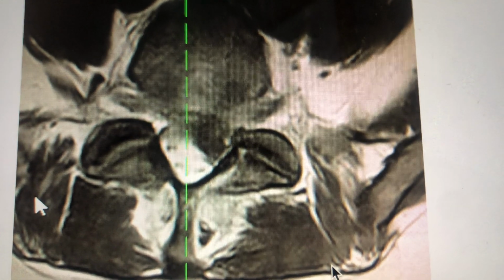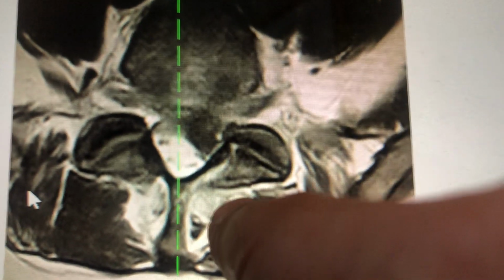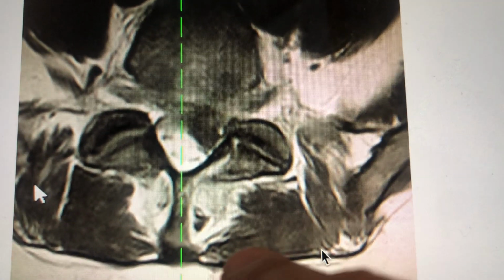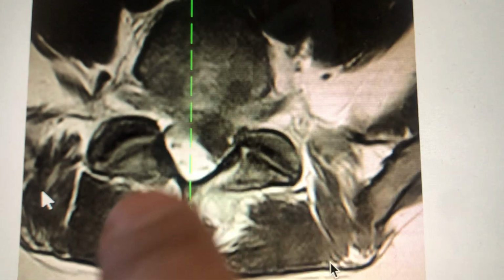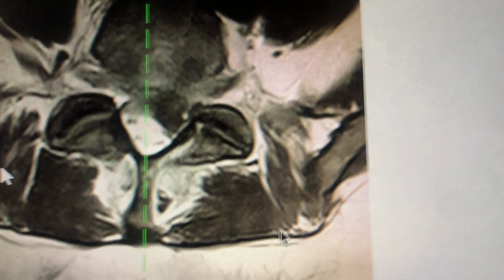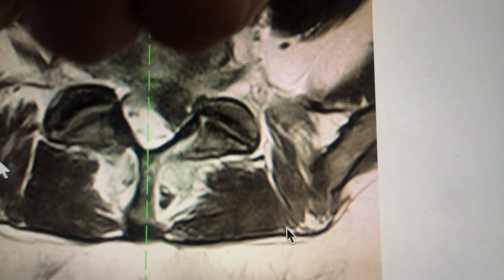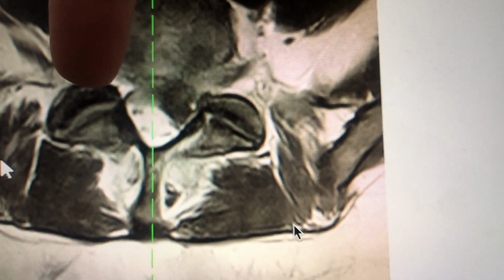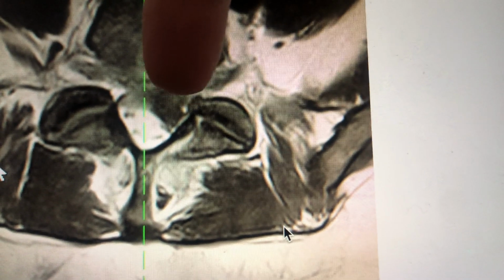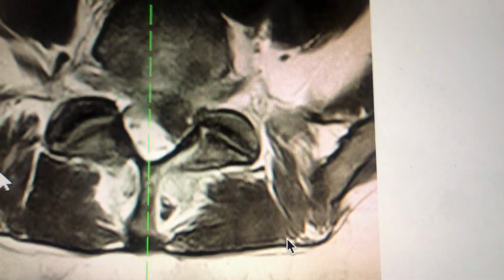Now, I want to orient you because it so happens that there's more right there. That is actually on the person's left side. And the reason I say that is because the image here is oriented such that this is the back of the person, the belly of the person would be up that way, and the person's laying with their head at the far end and the feet at the near end. I've discussed this before with you. If the feet are at this end and the head is at the far end and they're laying on their back, that means that this here is the right side of the person. This is the left side of the person. So since most of this disc mass is on the left side, then the nerve roots, which are on this left side here, are compressed and causing sciatica pain down the left leg.